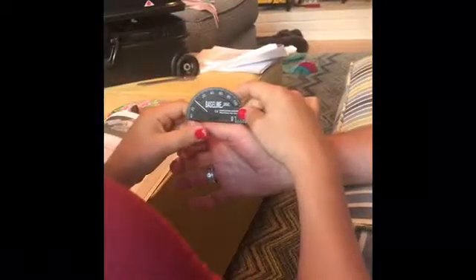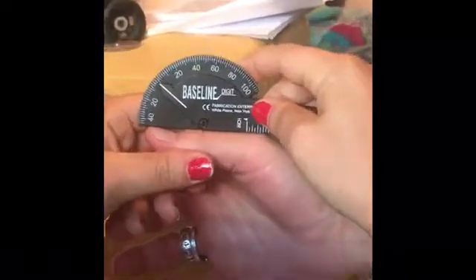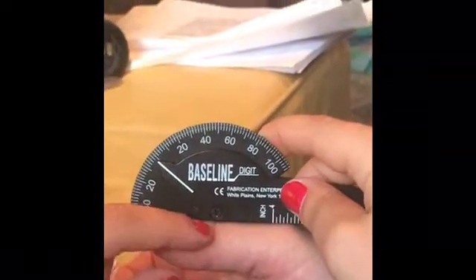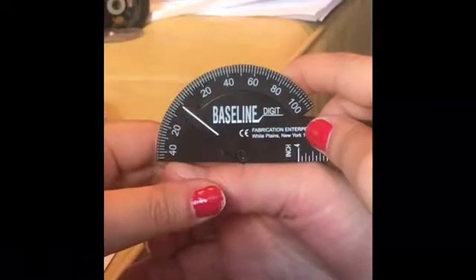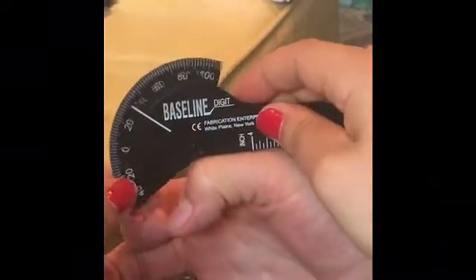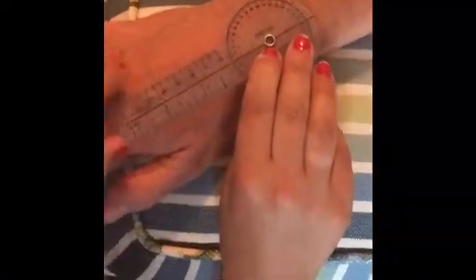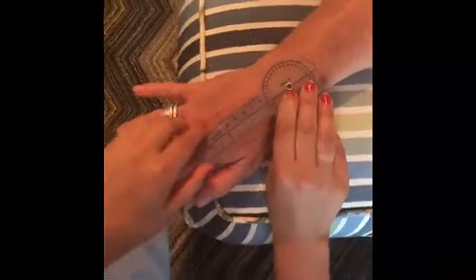We're going to be measuring thumb IP joint flexion range of motion. Range of motion is typically 0 to 80 degrees. The axis is the dorsal surface of the thumb IP joint. The stable arm is midline dorsal surface of the proximal phalanx, and the moving arm is midline dorsal surface of the distal phalanx. So go ahead and flex that. And it's at 70 degrees. Cut.